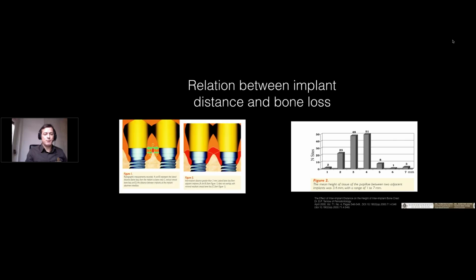I told you that before, because we have to change our outcome totally, because all the research in the past from famous guys like Tarnow, as you see on the pictures, is with one implant system. And these guys told us these rules for every implant. That's not true. If you have more modern implants, like a Noble Active, like the tree you saw in pictures before, it's different. Tapered implants have totally different connections between the abutment and the implant.